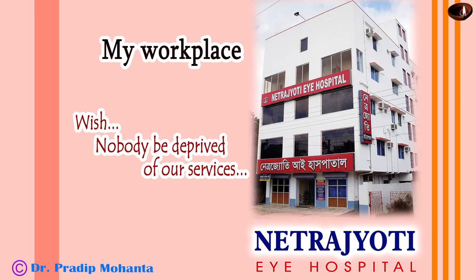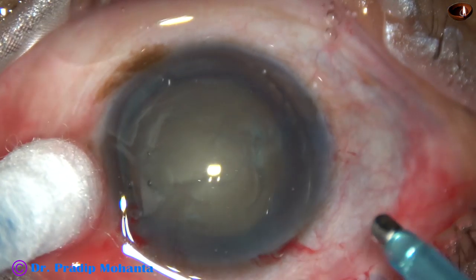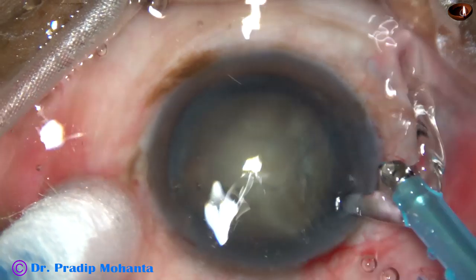Friends, welcome to my workplace at Ranaghat, West Bengal, India. In this video, I am going to demonstrate two cases of nucleus management by divide and conquer technique.